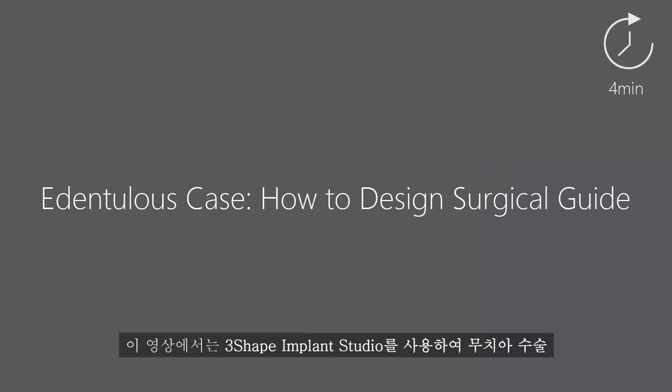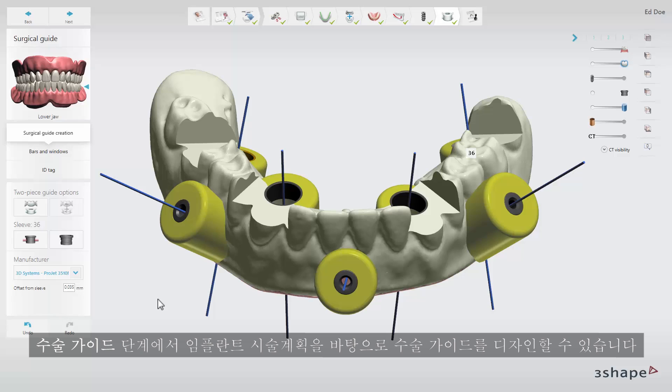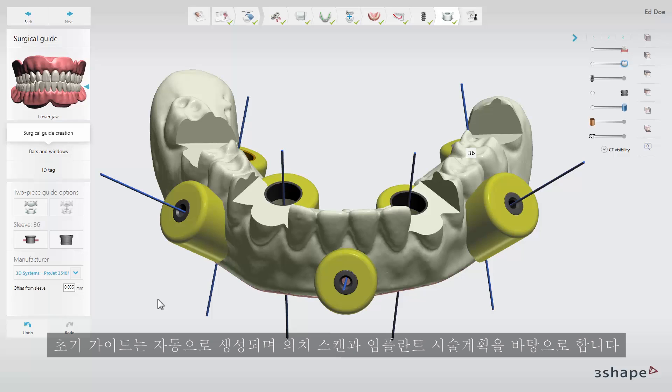In this video you will learn how to design an edentulous surgical guide with the 3Shape Implant Studio. At the surgical guide step you can design a surgical guide based on your implant planning. The initial guide will be generated automatically and is based on the denture scan and the implant planning.